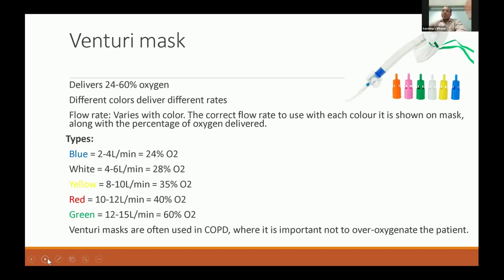This is the lowest one, and the highest one would be the green system, where you can achieve FiO2 of up to 60% by the use of a higher flow of oxygen. The Venturi, which is color coded, is something that you need to choose, and according to that, there is the flow of oxygen in liters. All that flow is also written on the Venturi mask.